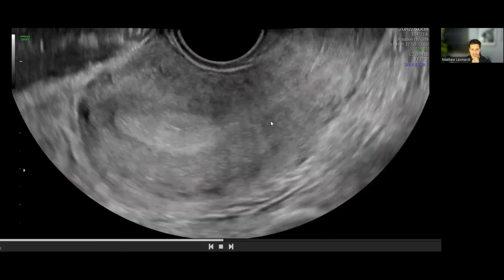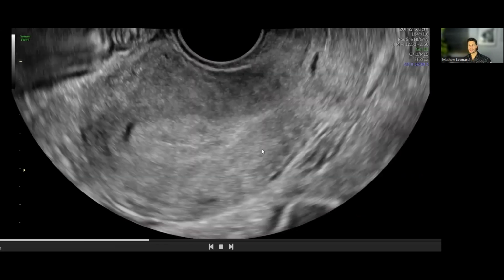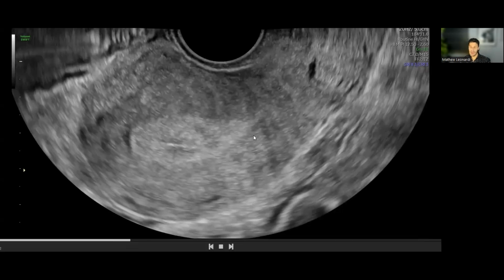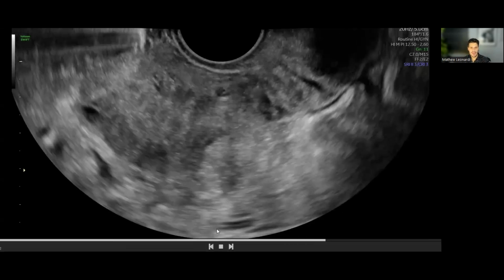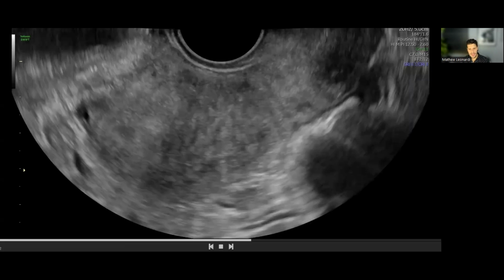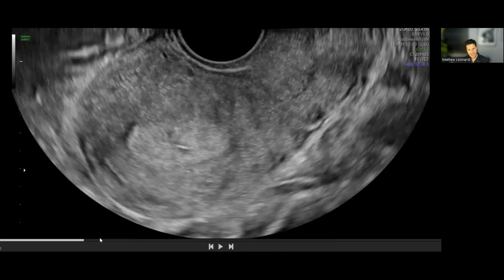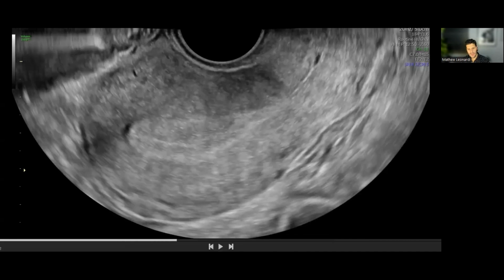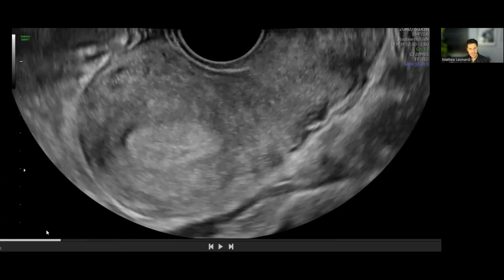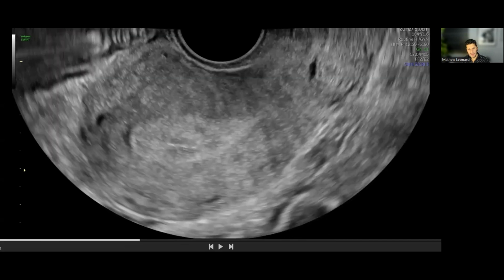So my sonographer is spending a little more time with cine loops. I think now they've done their measurements, they've done their routine things. They're going to go deeper and try to find the pathology. Maybe they already knew that it was there, maybe not. Maybe now it's when they're really seeing it. So I'm not getting anything new on the cine loop, I don't think. Just going to pause it and scan through it. What I already think we knew about was this area right here, which I still know about. Not a whole lot else for me to see here.